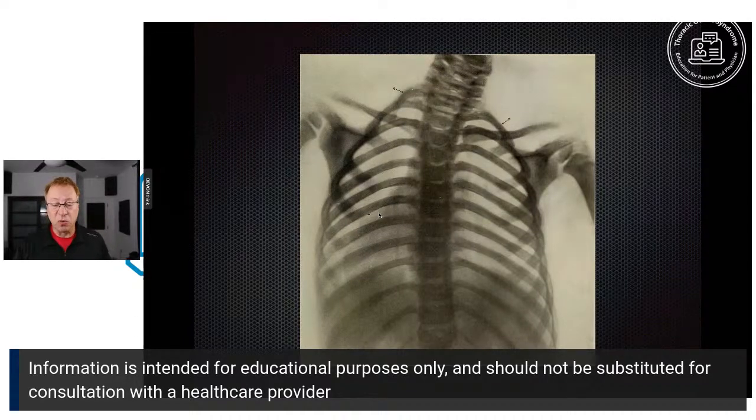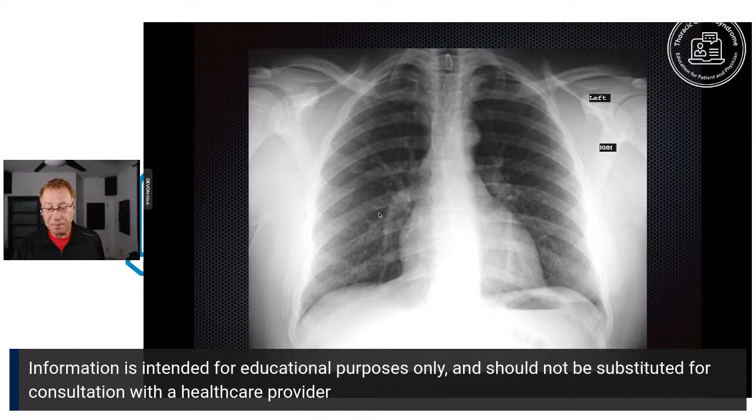You can see cervical ribs if you look closely at the top. Right after Röntgen discovered X-rays, people found that patients with these strange symptoms in the nerves of their arms had an extra rib, a cervical rib, on this new fantastic X-ray. And so they came up with the name cervical rib syndrome. But it's not as simple as all that.